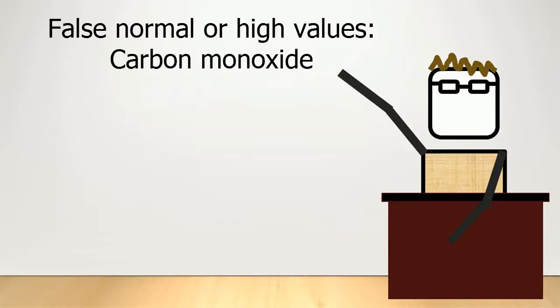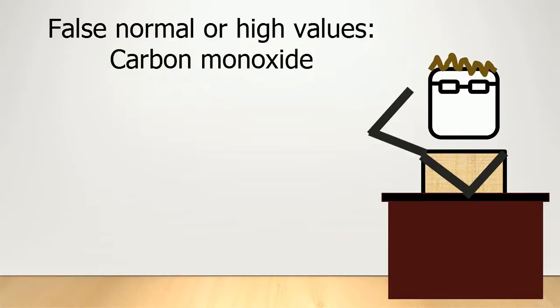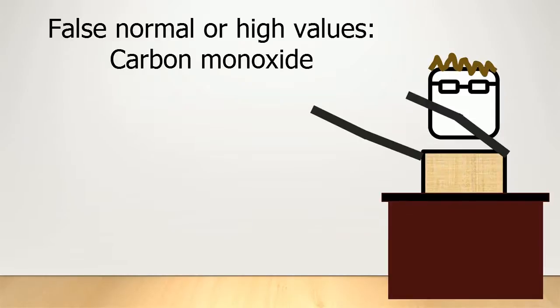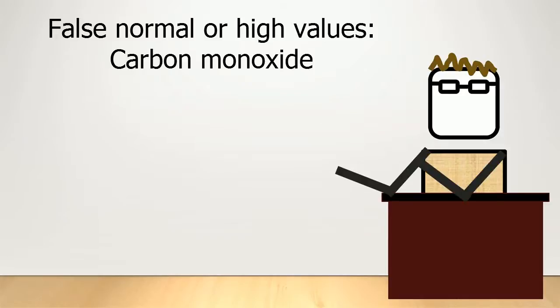If you're ever in doubt about whether or not the oxygen saturations are artificially high because of carbon monoxide, then the best thing to do is to increase the amount of oxygen being delivered and get a proper arterial blood gas, as most commercial freestanding blood gas machines have co-oximetry, which means they have the ability to distinguish between carbon monoxide bound hemoglobin and regular oxygenated hemoglobin.